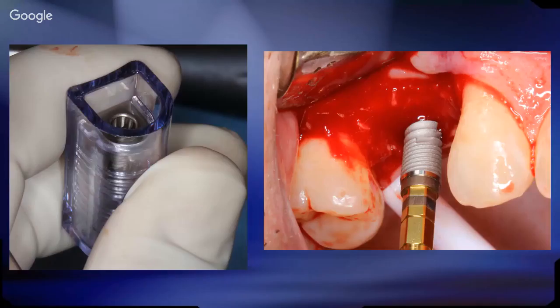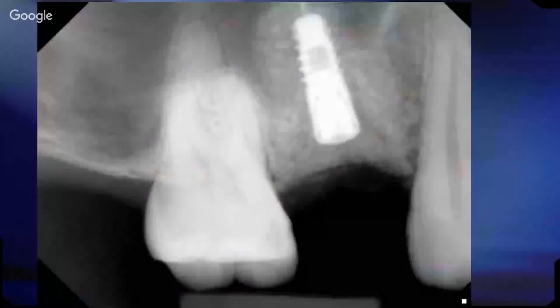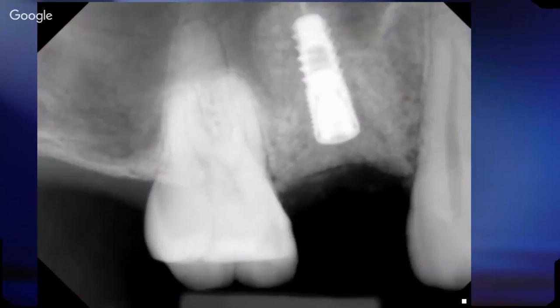And then we go ahead and place our implant to depth, which is going to be past the bony floor of the sinus. And that's what the final x-ray looks like. You can see we nailed it as far as directing the implant right into the septum. I don't know if you can see my cursor here on the screen, but right into the septum to take advantage of that bony septum to fixate the implant.